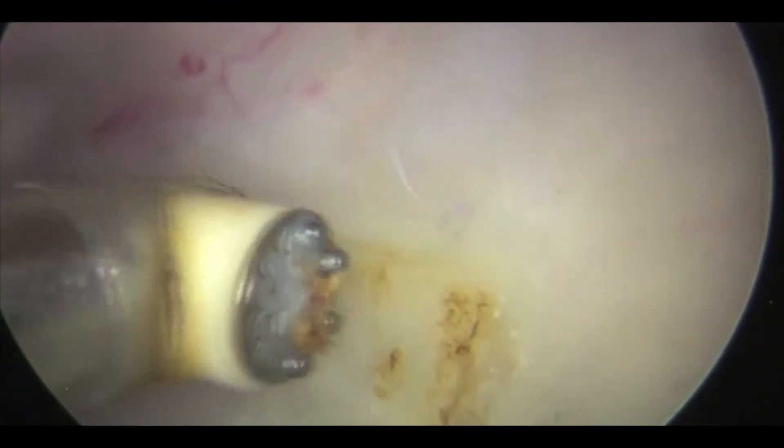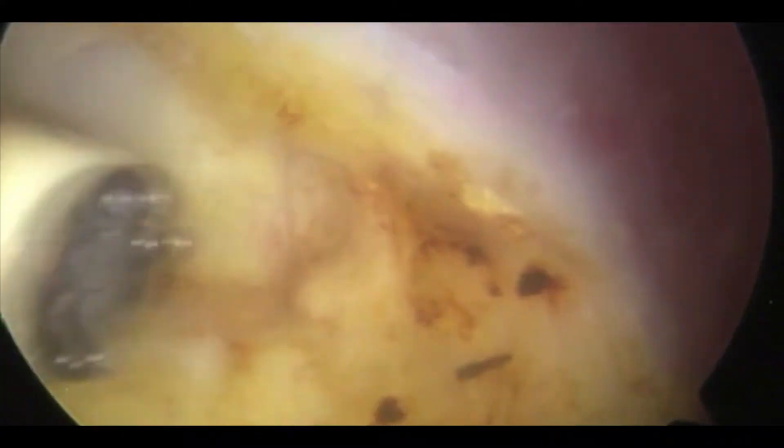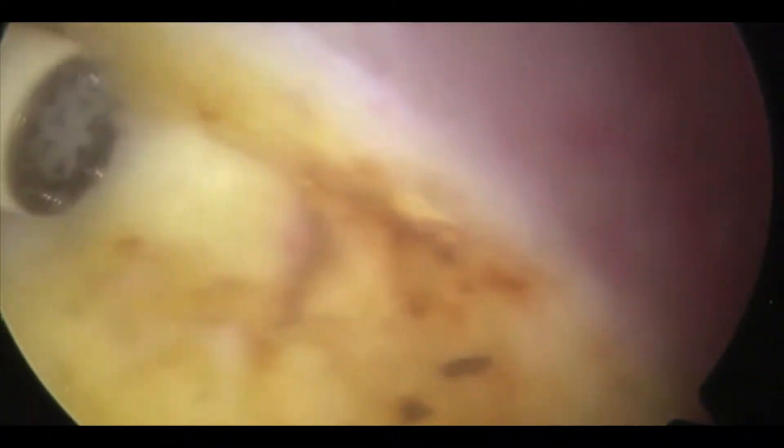The scope is viewing laterally in the sub-deltoid anterior compartment. The probe is being used to feel the top of subscapularis. With the radiofrequency probe, we're now dividing the top of the transverse ligament, and you just begin to see the long-headed biceps.